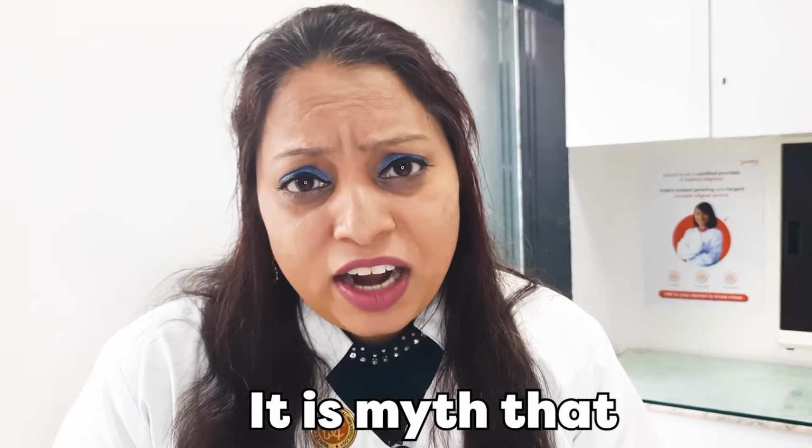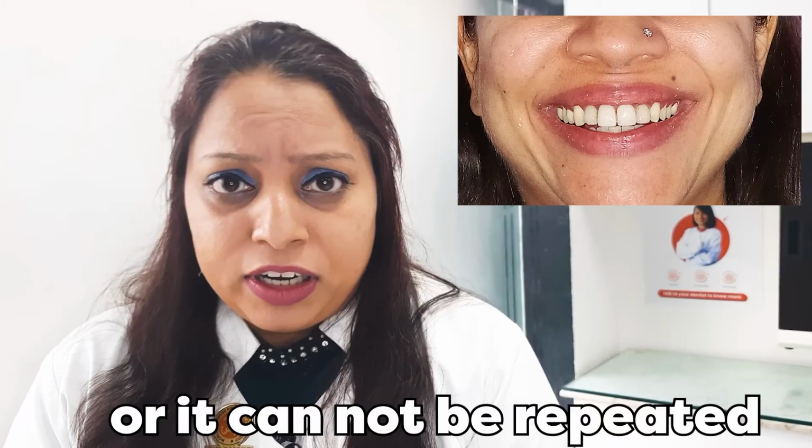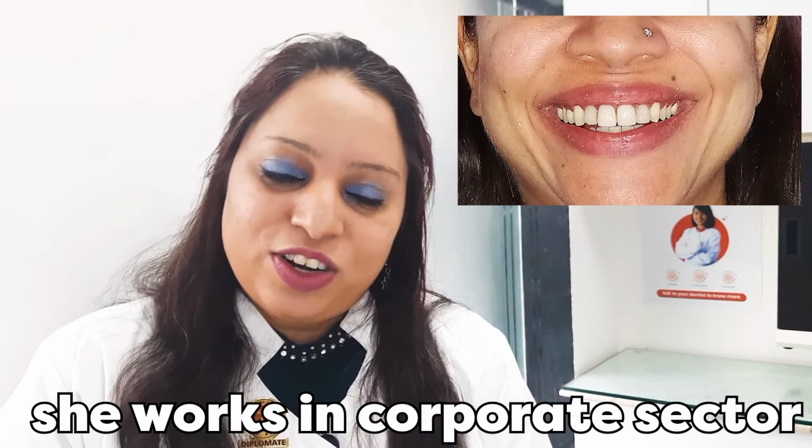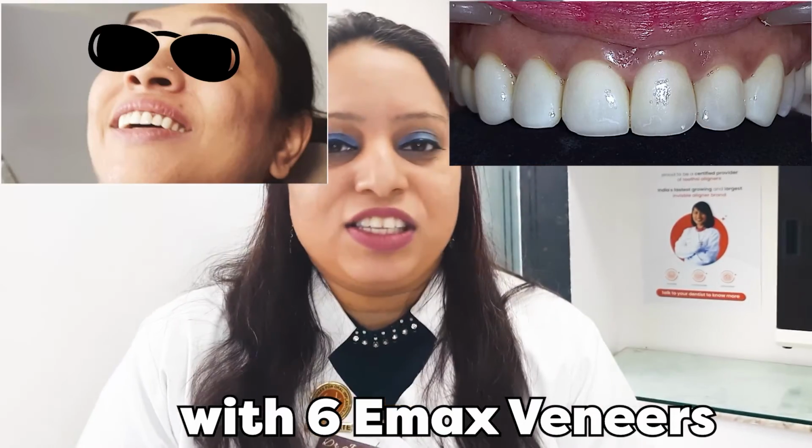It is a myth that veneers should only be done one time or that it cannot be repeated. For this lady, who works in the corporate sector, the upper 4 veneers were replaced with 6 Emax veneers.